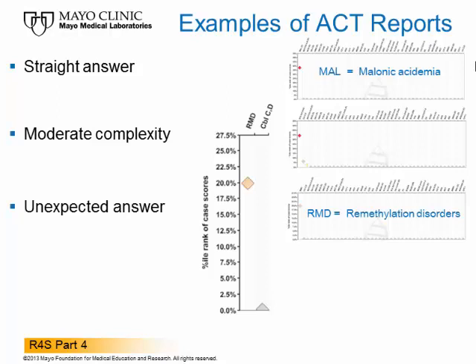This is unfortunate because the availability of a highly dependable second-tier test for the other characteristic finding of this disorder, hyperhomocystinemia, can drive the specificity of screening for this disorder to virtual perfection with no false outcomes.